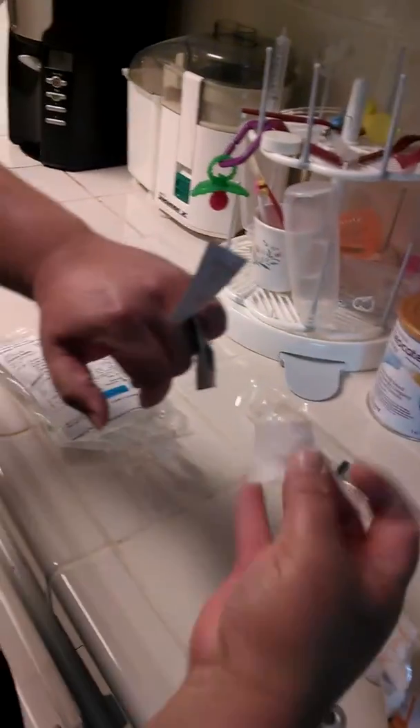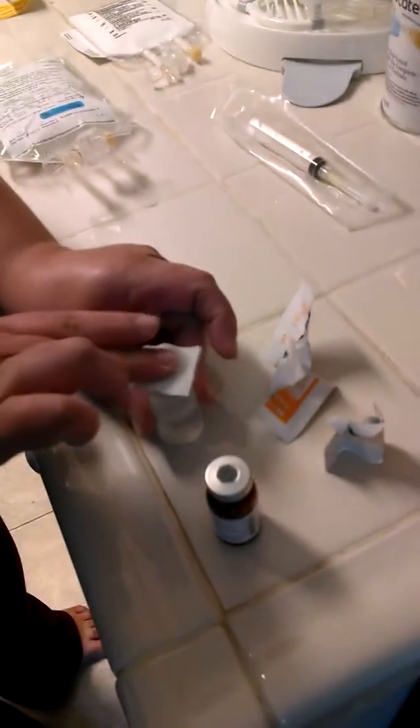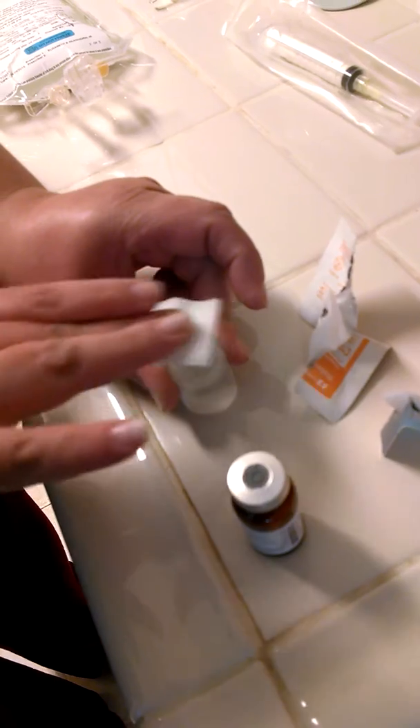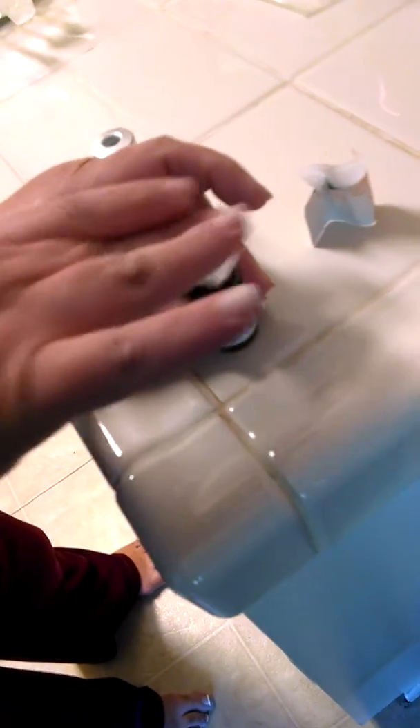First thing you're going to do is take an alcohol swab and use it between your hands to get rid of the packaging. You're going to scrub hub 15 to 20 seconds. Discard, grab another alcohol, scrub hub 15 to 20 seconds.